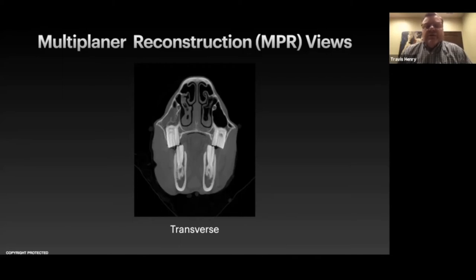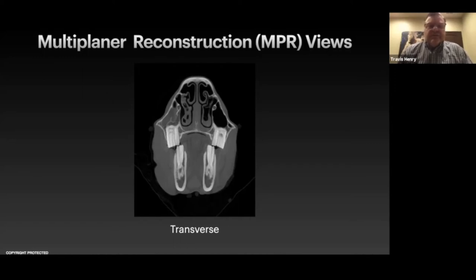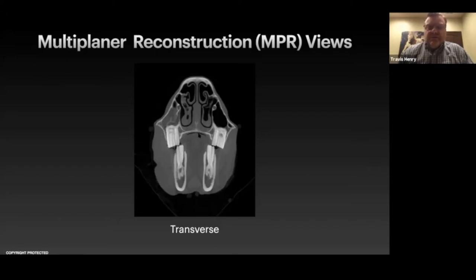The first thing we need to understand is the three-dimensional image planes we typically see. The first is the transverse image — a cross-sectional view of the horse's head. In this view we can see the sinus compartments, the nasal passages, the bullae of the nose, and the rostral maxillary sinus. In this horse we can see bone lifting off of a tooth and sinusitis — this tooth is going to be a problem.